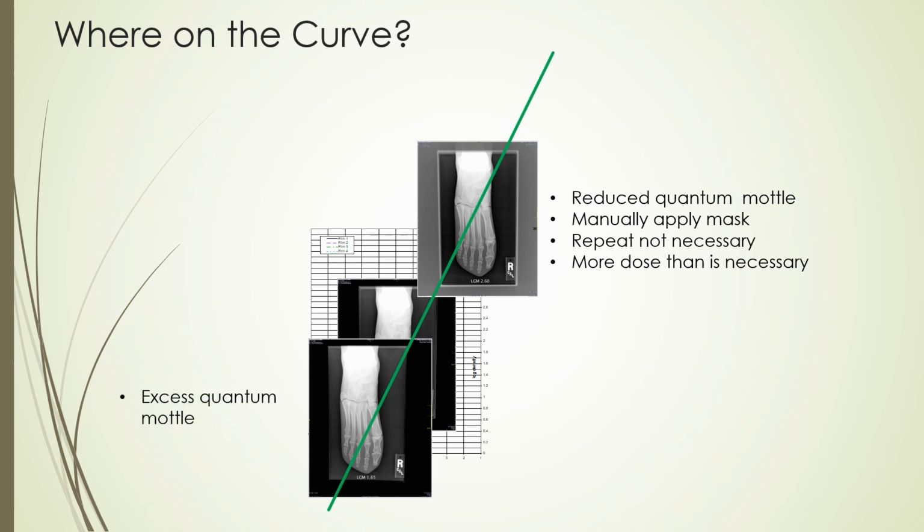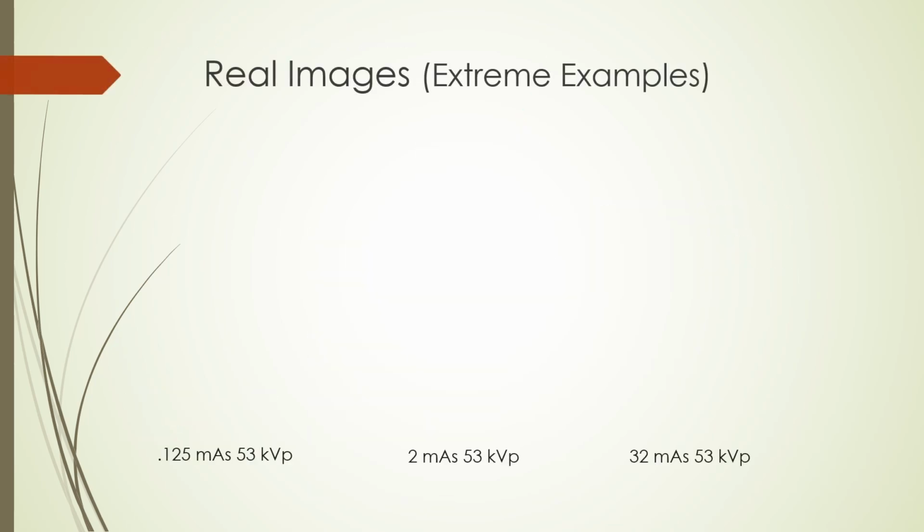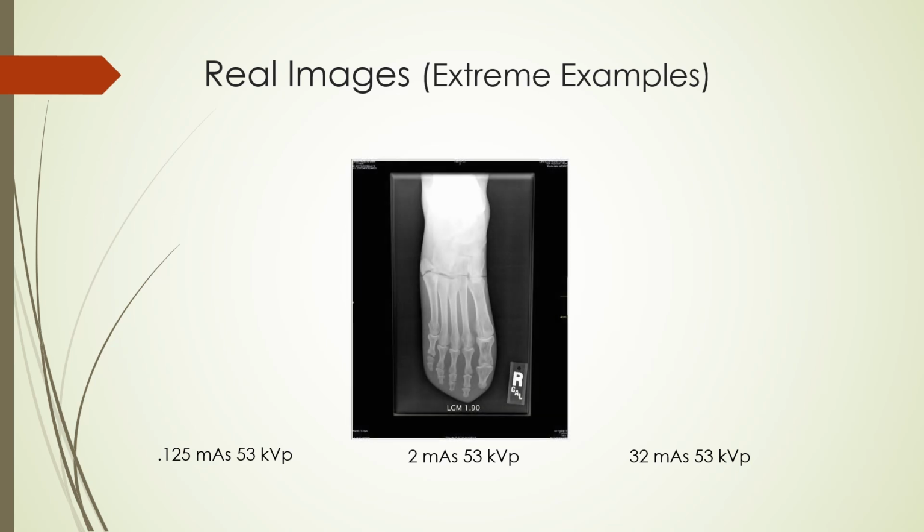For the 2 times underexposed radiograph, there is not enough radiation reaching the imaging plate, and the result is quantum mottle. I'd recommend a repeat exposure, especially if fine visibility of detail is necessary for the diagnosis. Let's compare some images where the exposure defect is not correctable and obvious. Again, the middle exposure is correct and in an acceptable exposure range.